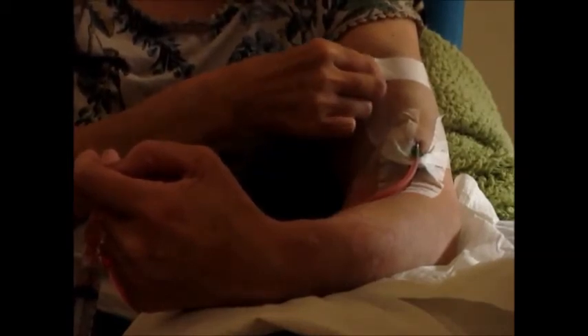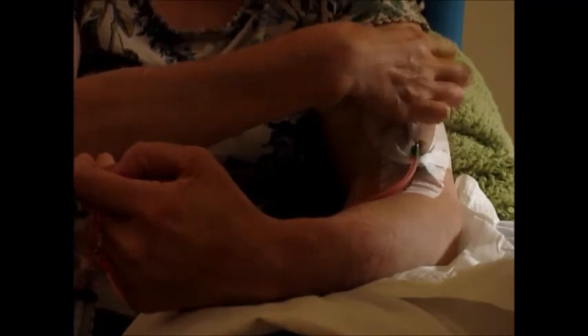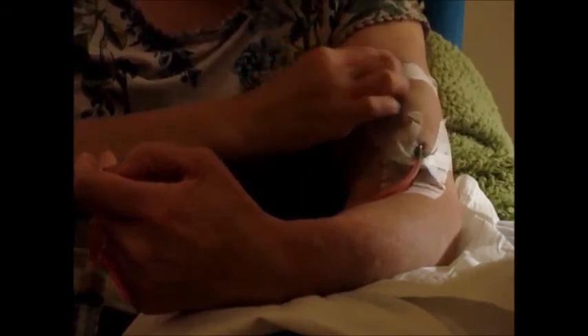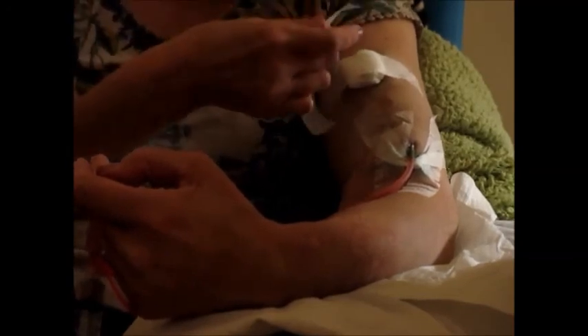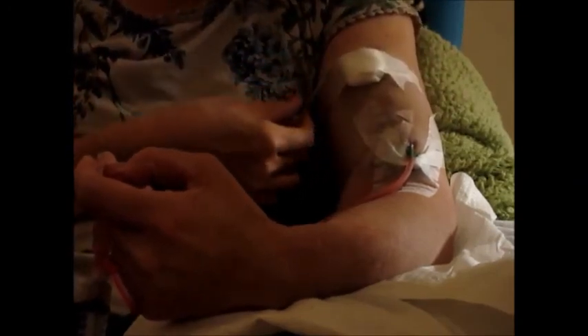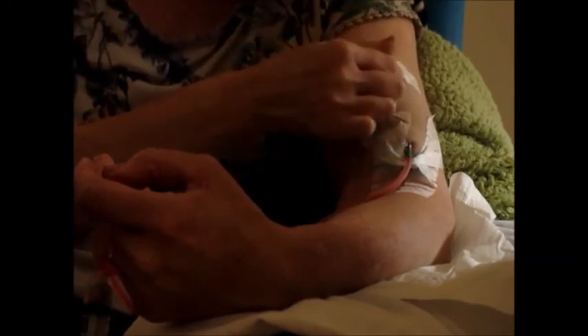I hope people really do consider the possibility of doing home haemodialysis if it is offered to them. It really does give the individual more control over their treatment, and I think that's one of the things when someone's diagnosed with an illness — that sense of loss of control — and being able to do your own treatment helps give some of that control back. To put the other tape on, I just tend to curve it round on the bit that's going to cross, to stop any excess tape sticking to the skin.